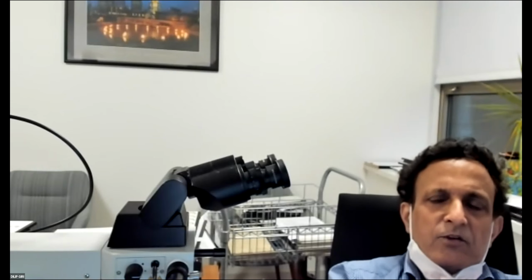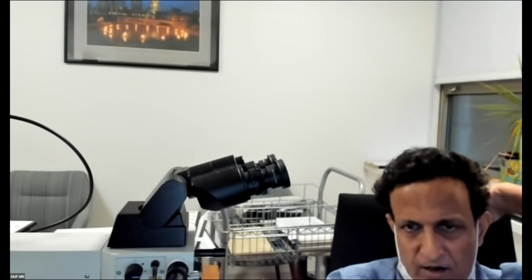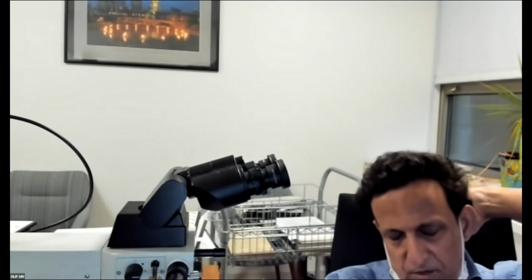When there is some or a lot of pleomorphic LCIS in a specimen, you will oftentimes see associated classic LCIS, because it's kind of a continuum. So there may not be any need to revise the margins, because the adjacent tissue next to the pleomorphic-looking LCIS is probably classic LCIS.